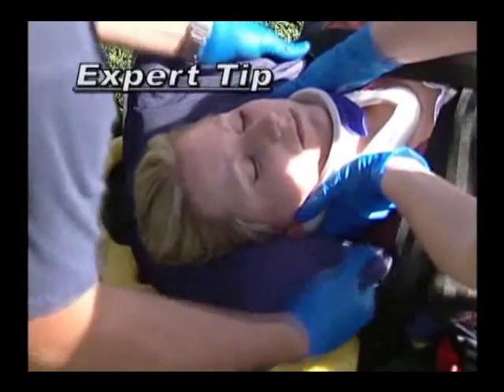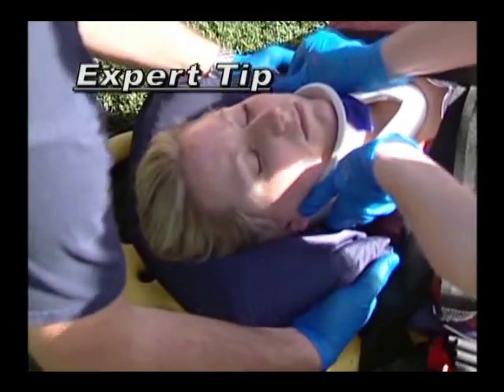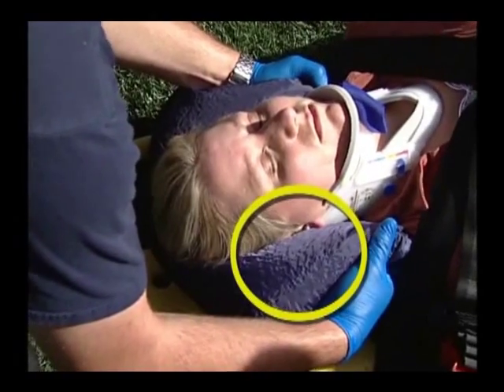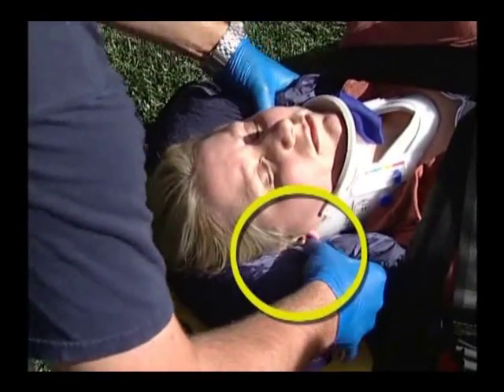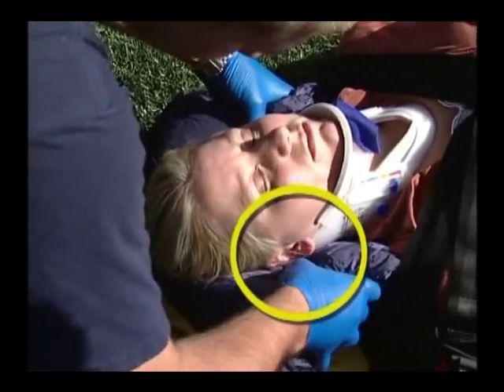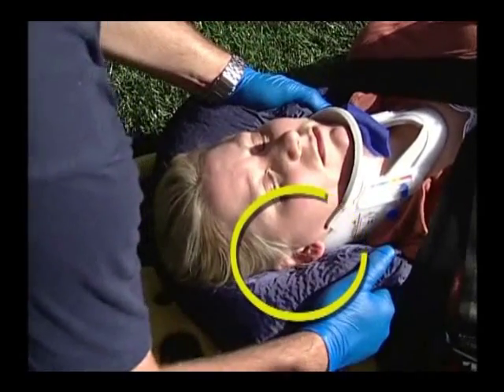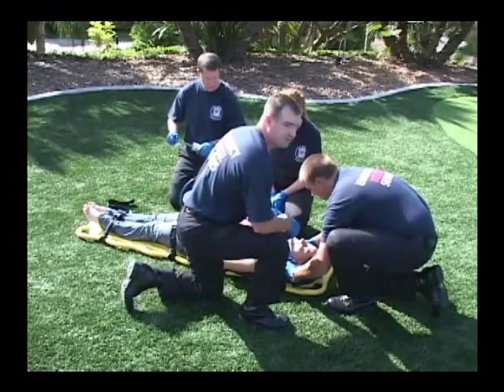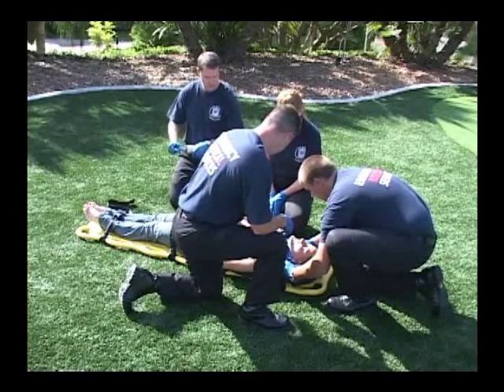Here's another streetwise tip. When you have evacuated about half the air from the splint, you can change the position of your hands and use your thumbs to create ear channels in the now clay-like splint to make it easier for the patient to hear. Finish evacuating the splint with your hands holding both sides of the evacu-splint.